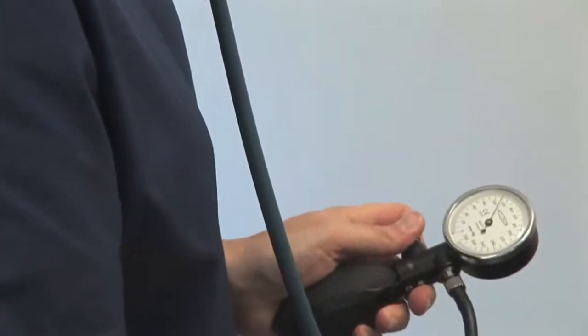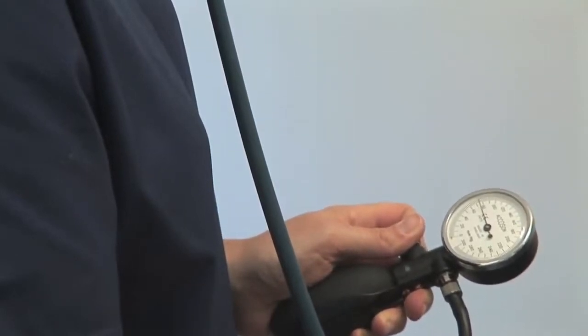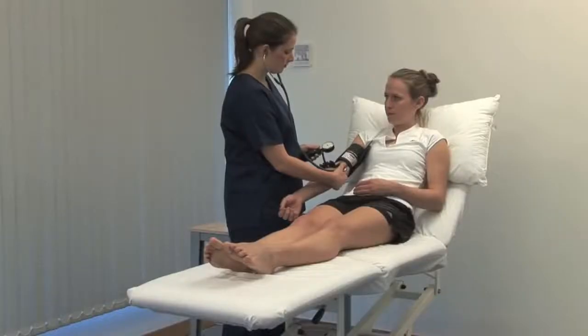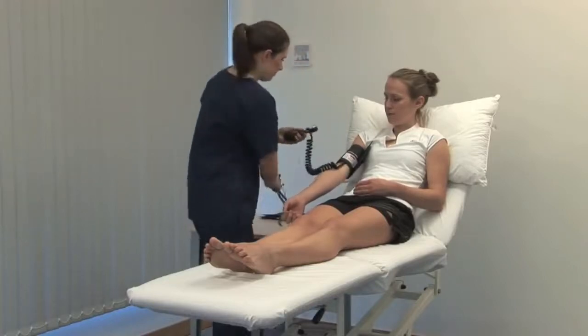Note the pressure at which the regular tapping Korotkoff sounds appear. This is the systolic pressure. Continue to slowly deflate the cuff until the sounds disappear. This value is the diastolic blood pressure.